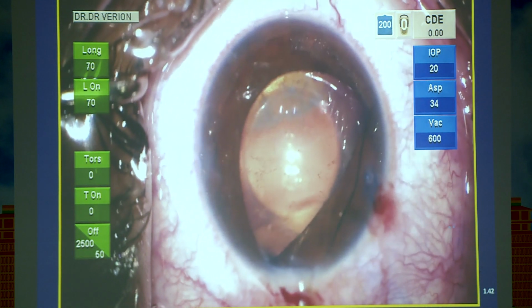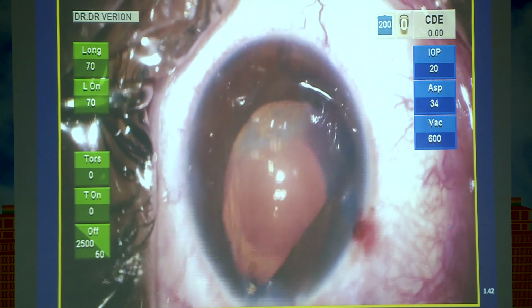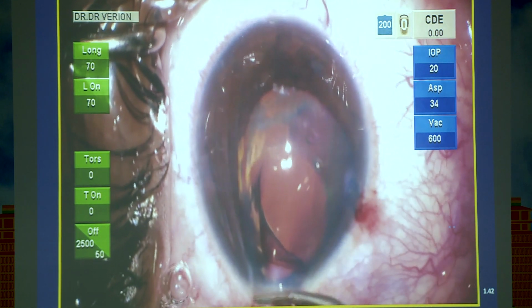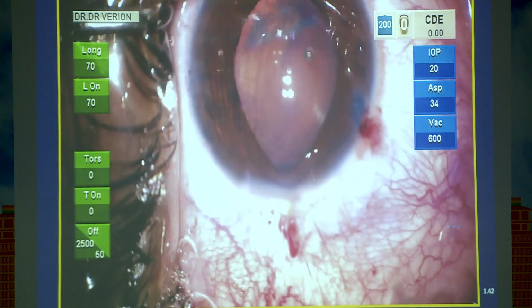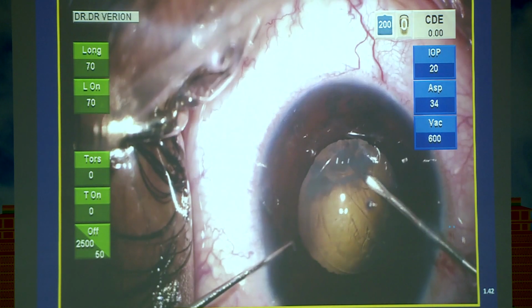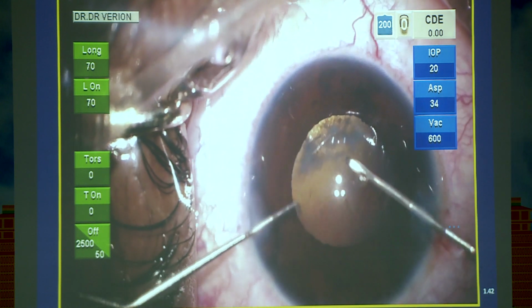And using a hand-over-hand technique, you can bring the lens out, and it easily slips out because of its collamer material, or the hydrophilic acrylic material, which is extremely pliable. The lens can just come out very smoothly, and you can see the ASC cataract that is impinging onto the center, that's causing a drop in the visual acuity. Most often these patients, that was a patient who had a minus 27 diopter power to begin with.